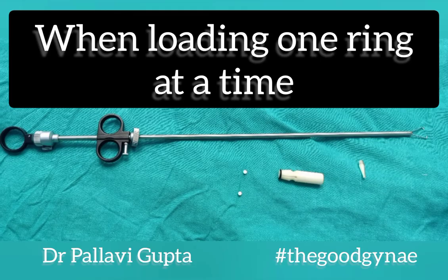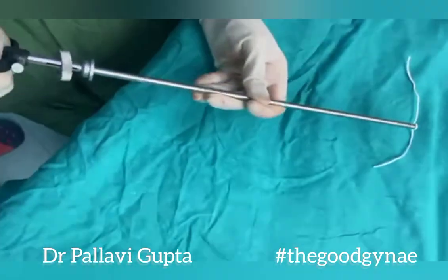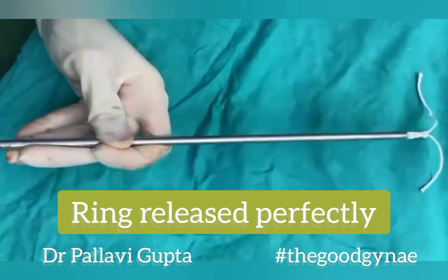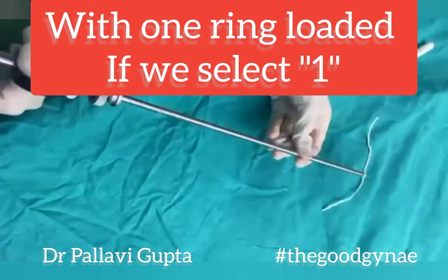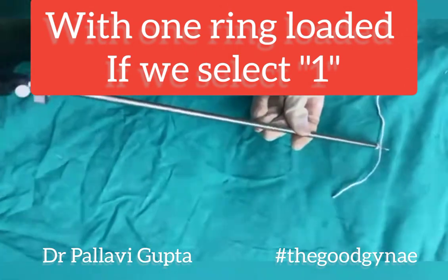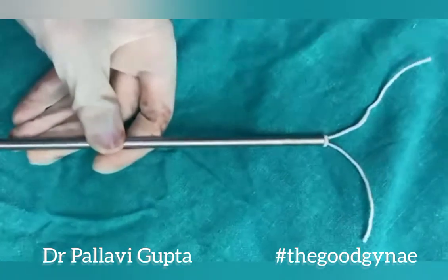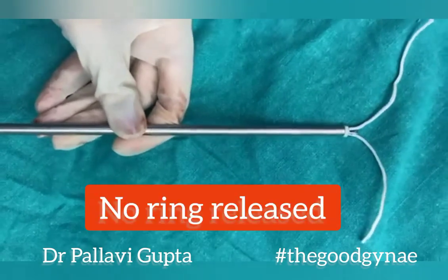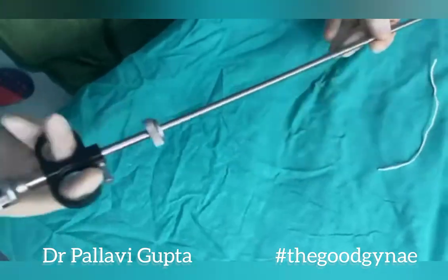When loading one ring at a time, we have to select 2 at the ring delivery collar, which releases the ring over the fallopian tube. Suppose we have one ring loaded and select 1 instead of 2 — the tube will be pulled inside the sleeve of the laprocator but the ring will not be released. There is a risk of transection of the tube, and this should be avoided.